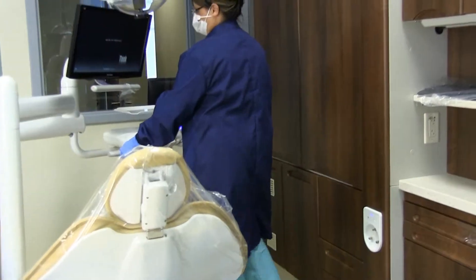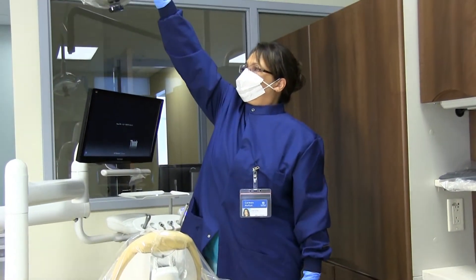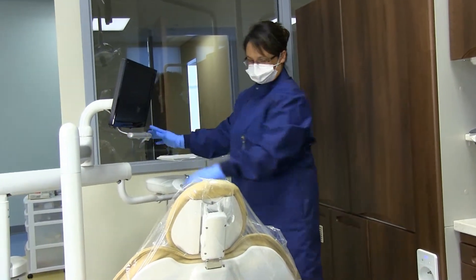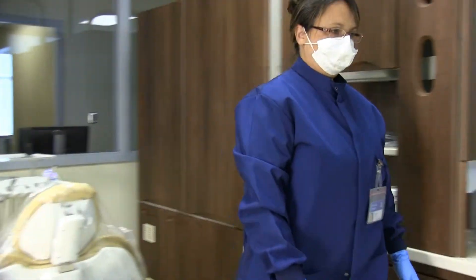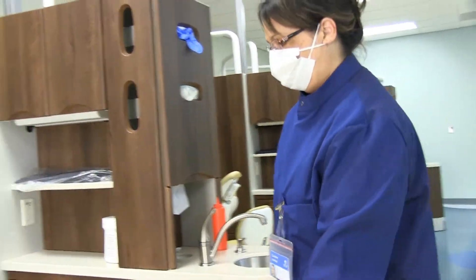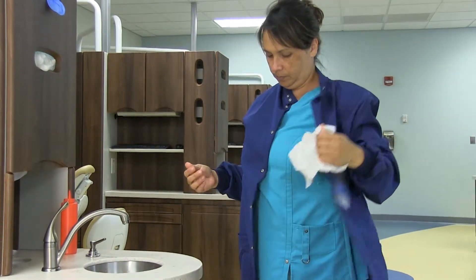Then arrange the unit and operator stools to allow a clear path for the patient. Place the armchair down. Remove and discard treatment gloves and wash hands or use antiseptic rub for the recommended time. Finally, with paper towels, remove your lab coat and your PPE.